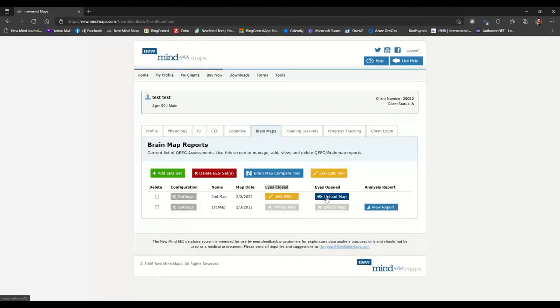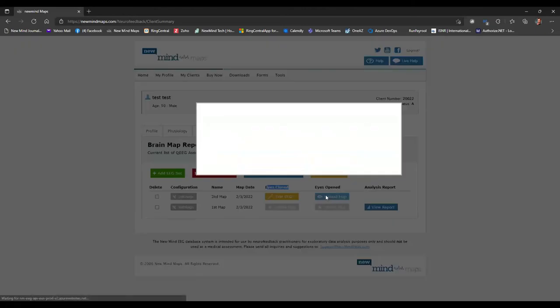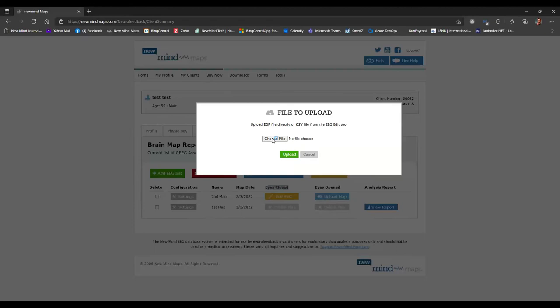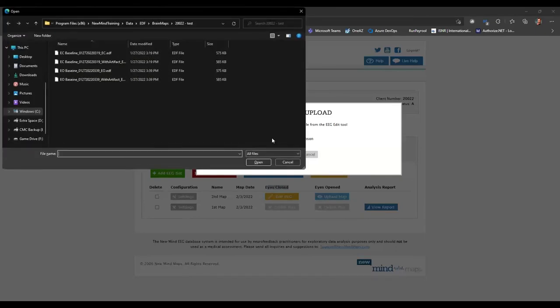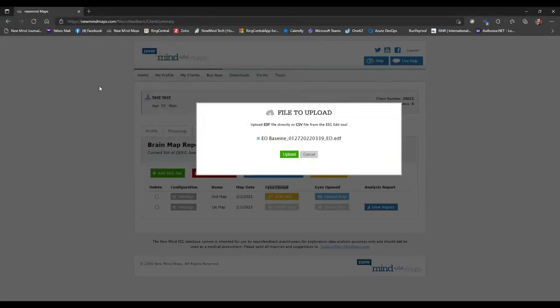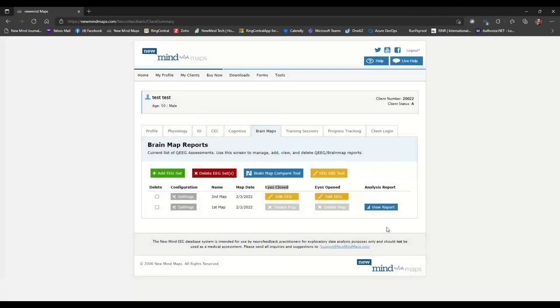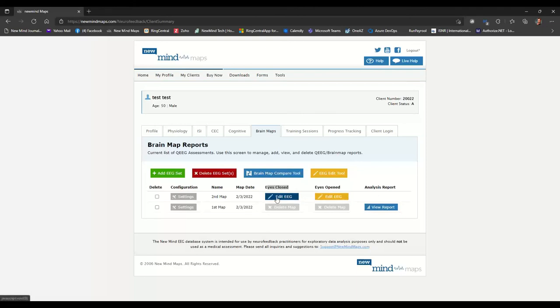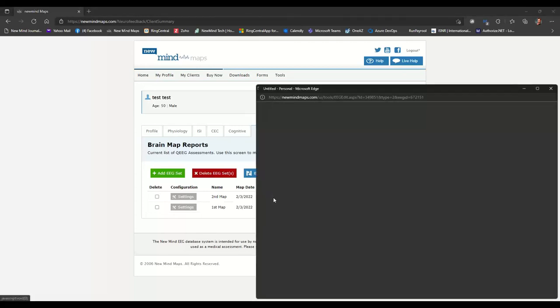All right, now I can go over and click on the eyes open upload map button. And we'll click choose file. And eyes open with the artifact removed is right here. So we'll double click on that and click the upload button. All right. So you'll notice we didn't automatically get a view report button here. But our buttons now say to edit the EEG. The file we chose has already been edited through our pro software. However, we still need to click on edit EEG.